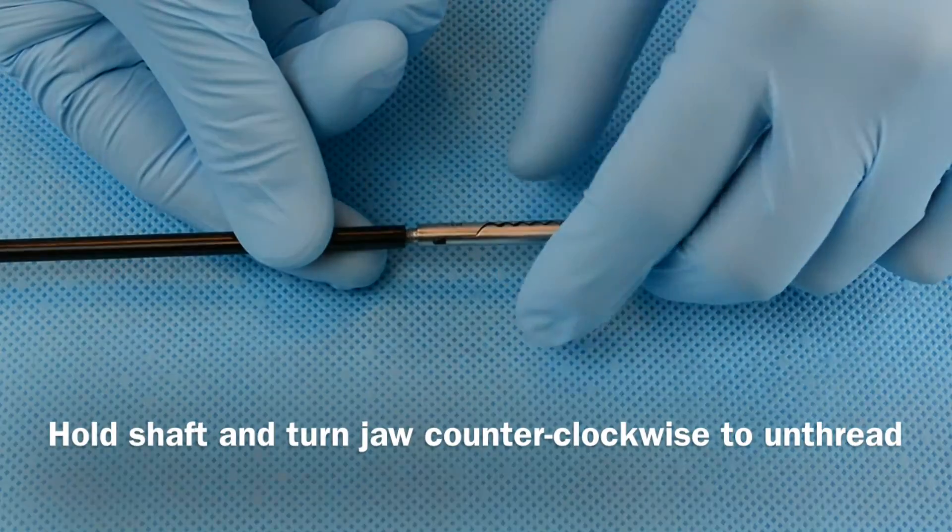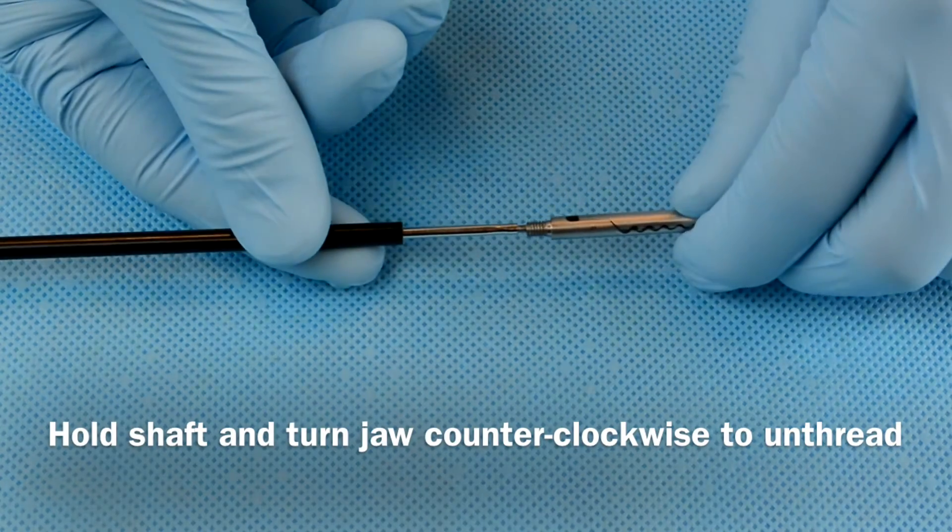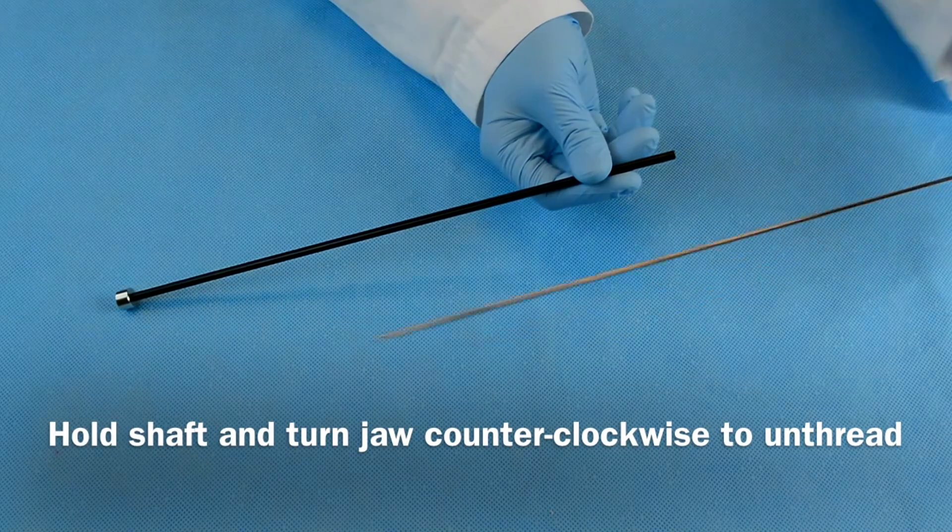Lastly, hold the shaft steady and turn the jaw counter-clockwise to unthread it. Then pull it out of the shaft.